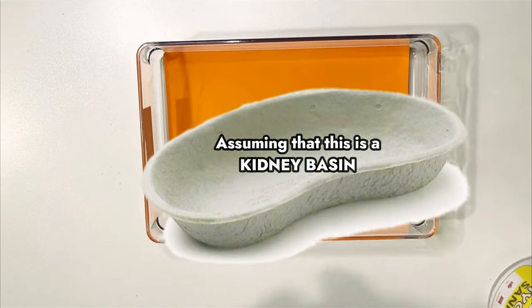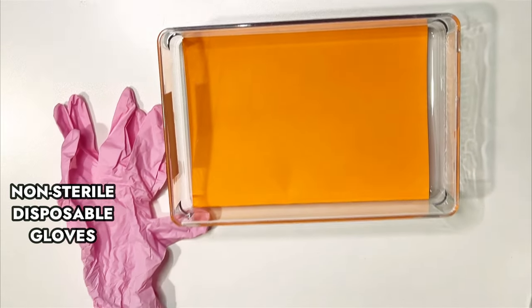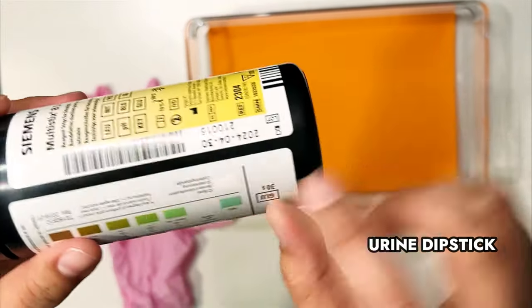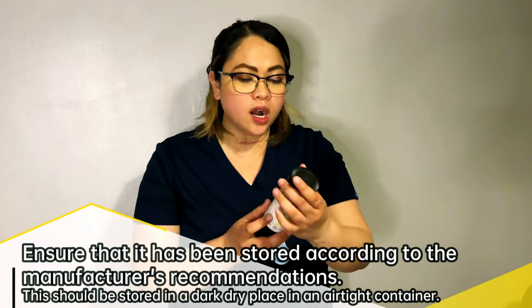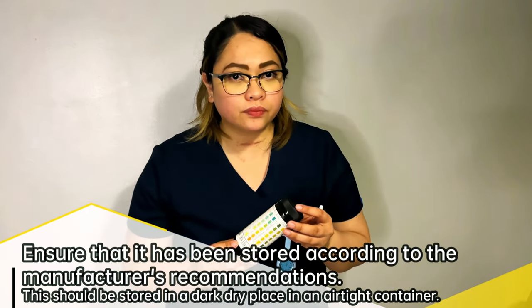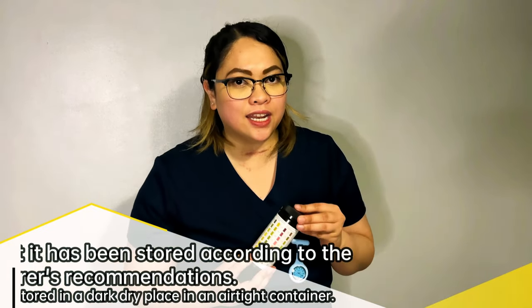Assuming that this orange tray is a kidney basin, non-sterile disposable gloves, urine dipstick. Miss Examiner, I can see that this urine dipstick is on date and the expiry date is 30th of the 4th, 2024. Has this been stored according to the manufacturer's recommendation? Yes. This should be stored in a dark, dry place in an airtight container.